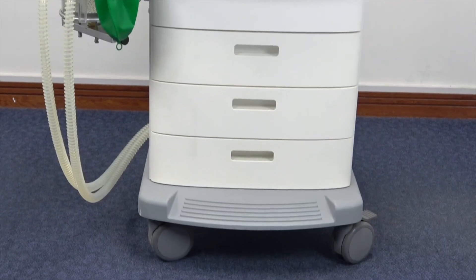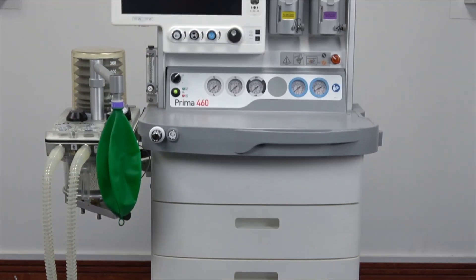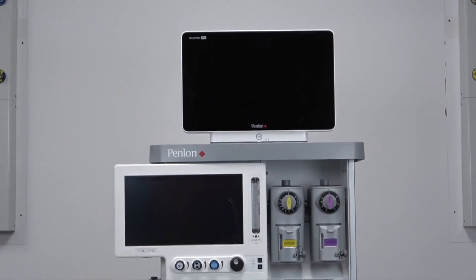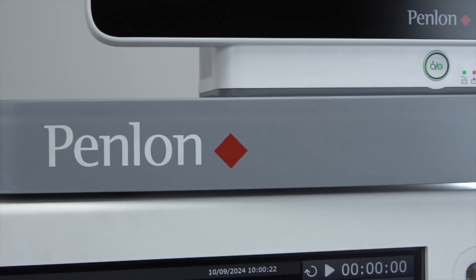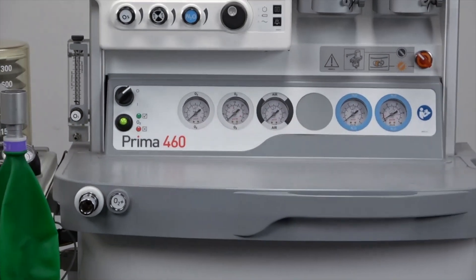This is the Prima 460, the latest anaesthetic machine from Penlon. Penlon is a UK-based company that has been proudly manufacturing world-class medical equipment for more than 80 years and currently exports to over 100 countries worldwide.